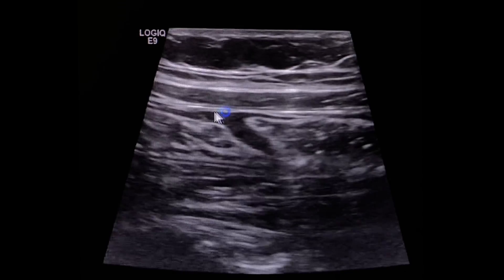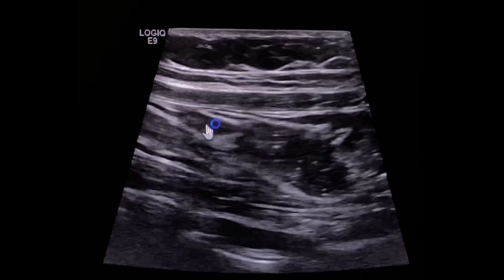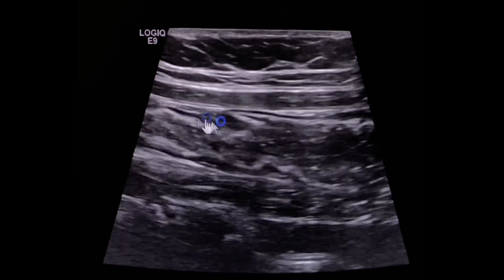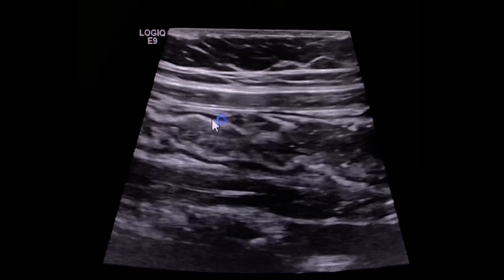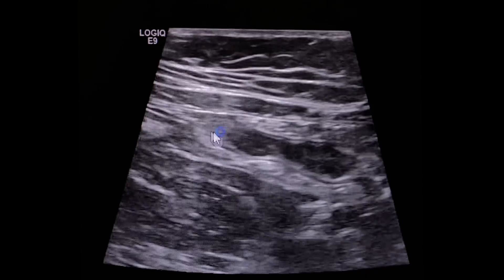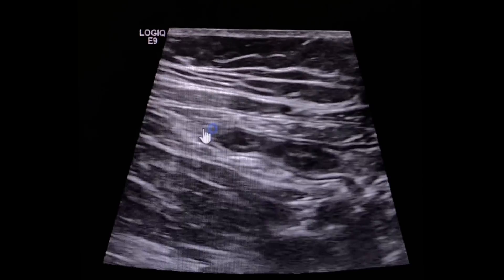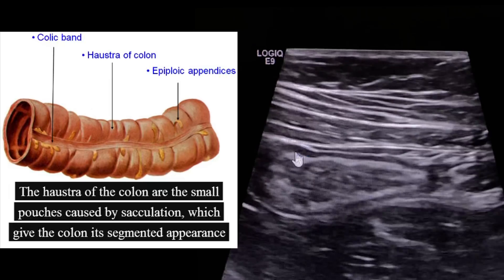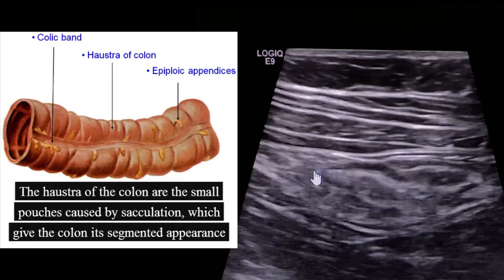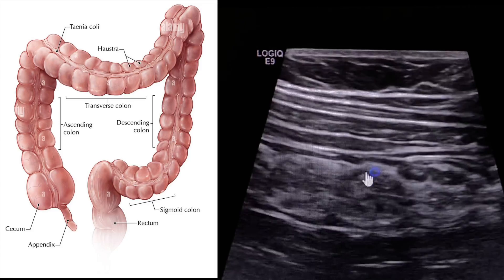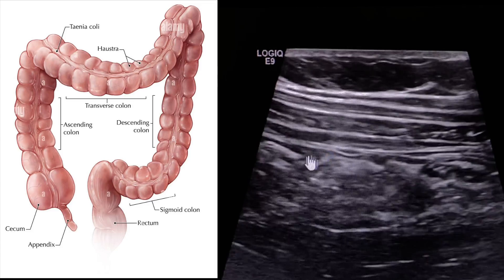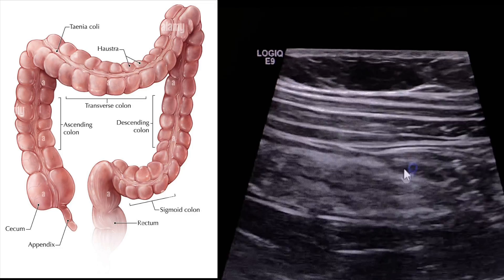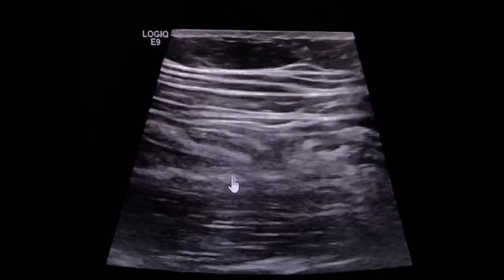The colon — the ascending colon has haustra. All of the colon, ascending, transverse, descending, sigmoid — all that stuff has haustra, which are like little pouches that are sometimes pretty visible with ultrasound. That's one right there, and that's another one right there. You'll see like little indentations in the mucosal tissue.